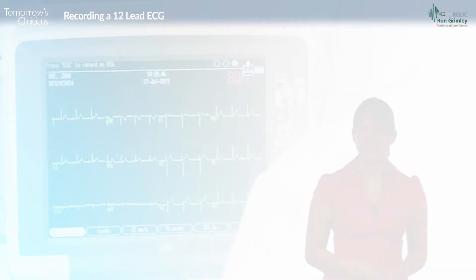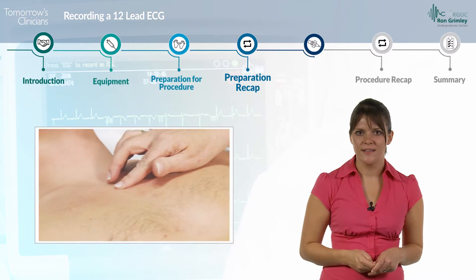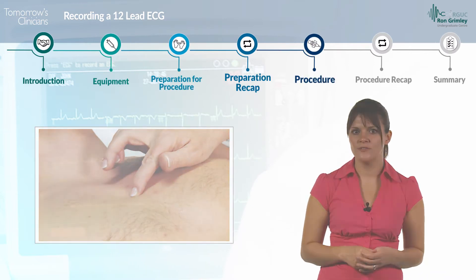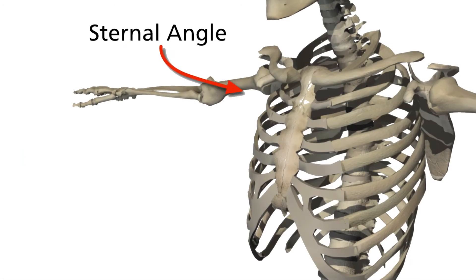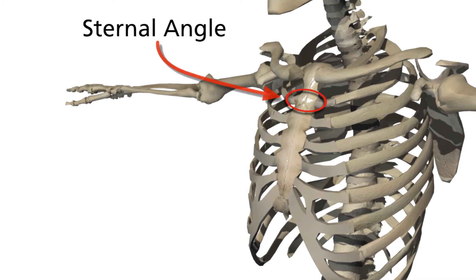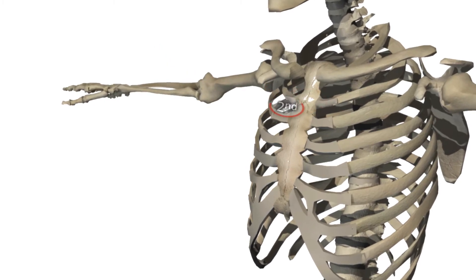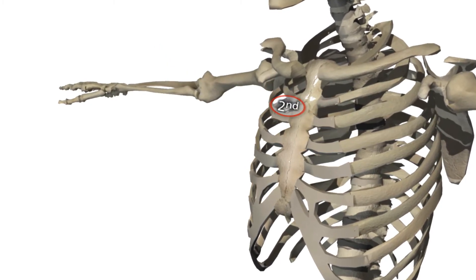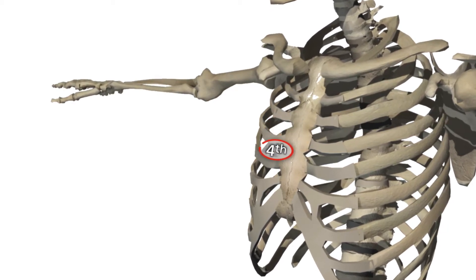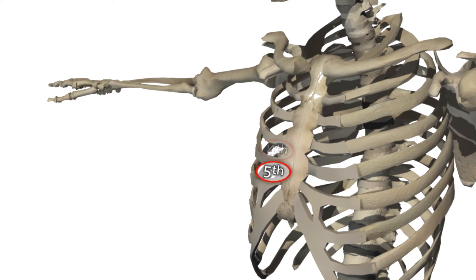Now move on to attach the electrodes for the chest leads. There are six chest leads. To locate the positions for these, use the sternal angle as a reference point to count down the intercostal spaces. The second intercostal space is directly below the sternal angle, and from here you can count down to the third, fourth and fifth intercostal spaces.